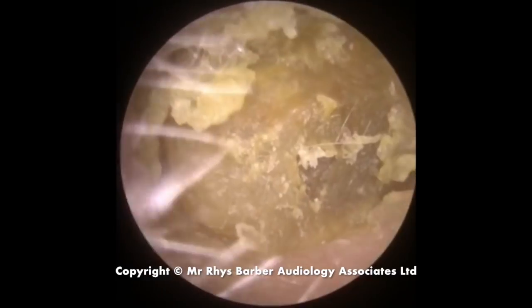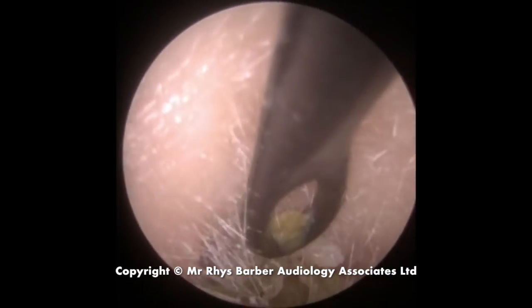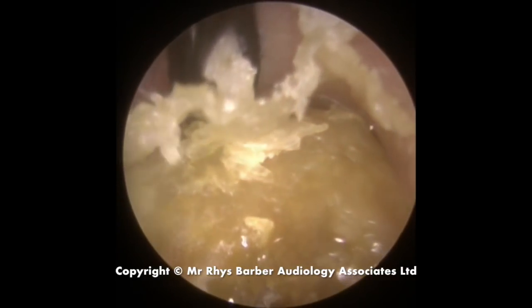This is the second ear — the patient has this problem on both sides. Same again, use a little bit of olive oil just to lubricate the canal. You can see a flap of dry skin that the Jobson horn is just tucking into there.